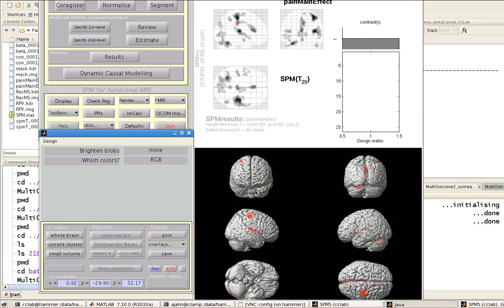Now here with the rendering, you can see more clearly where the activation lies on the surface of the brain. So in this case, even though I know that I have some activation in my anterior cingulate area, that's more of a medial structure, more hidden in the midline, and so you're not going to be able to see it very well on this rendered surface. However, I do get a better picture of the activation on the surface of the motor cortex.